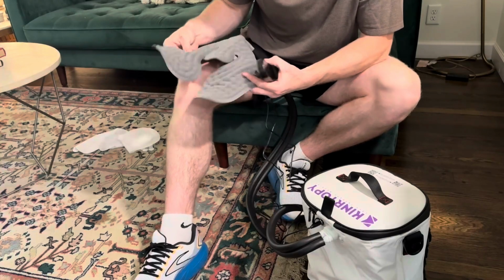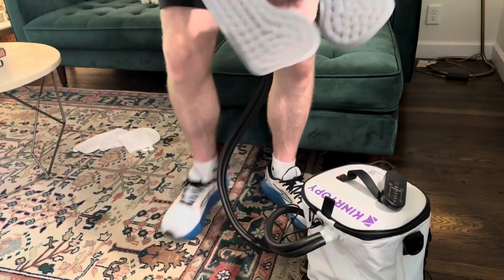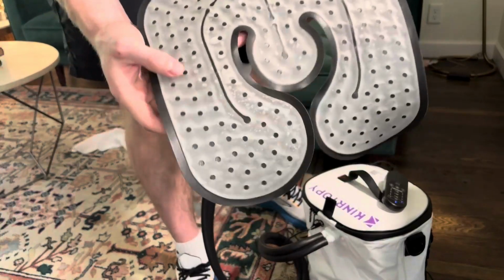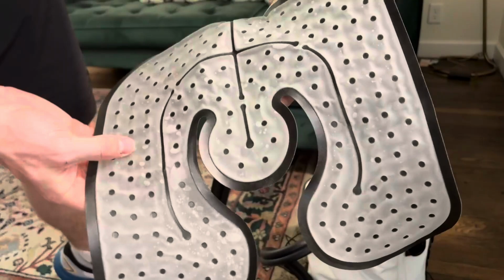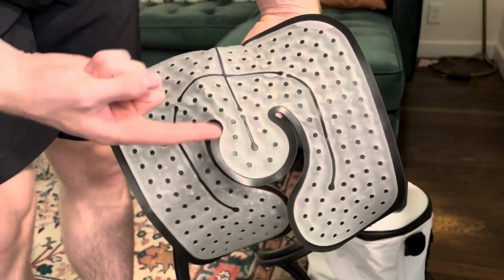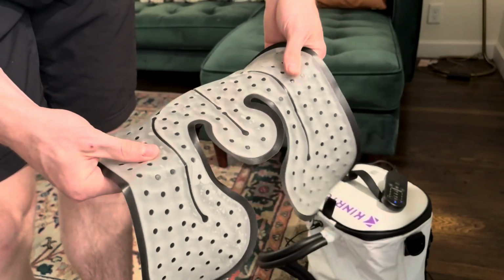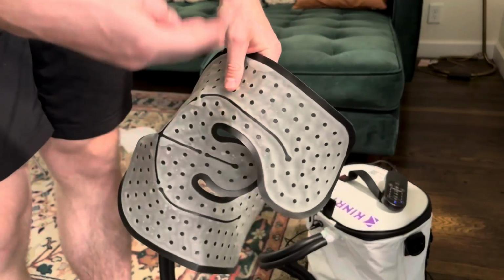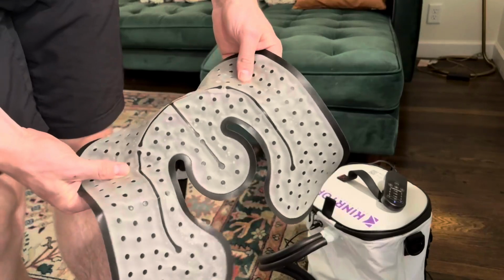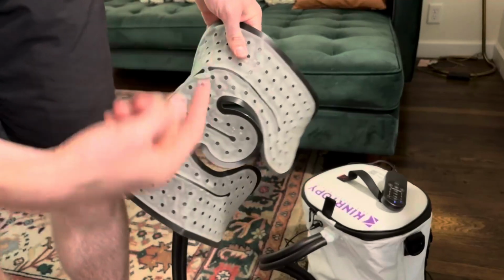And so basically how this thing is working, oh, that's actually cool. So you can see this side, that you can kind of tell what's going on, but if you flip it around, you can see the water actually. And it's one of those things that each of these little cells is full of water here, and it's circulating that cold water. If you were holding this, you could feel it vibrating just a little bit because you can feel the water moving, but it's constantly cooling. So as it's hitting your warm knee, it's not getting warmer, it's not getting stagnant, it's actually just staying as cold as it is in there, and it's just circulating that water.